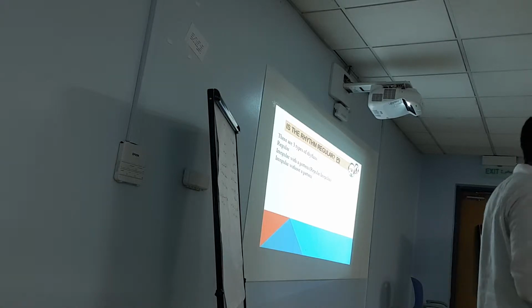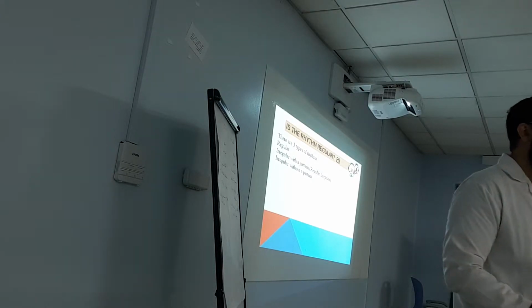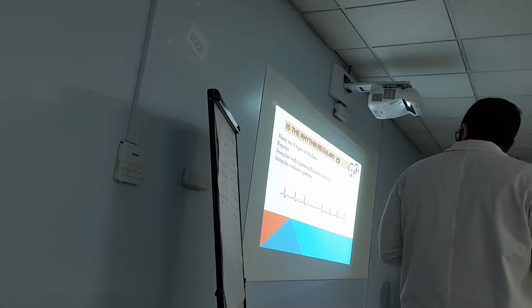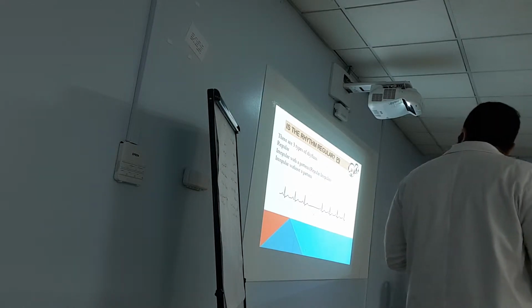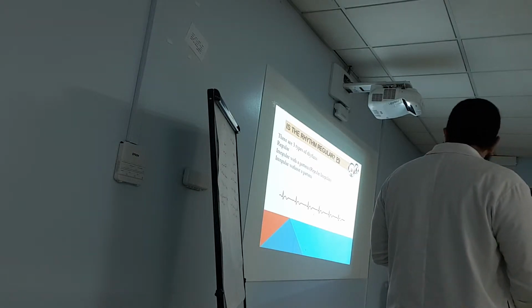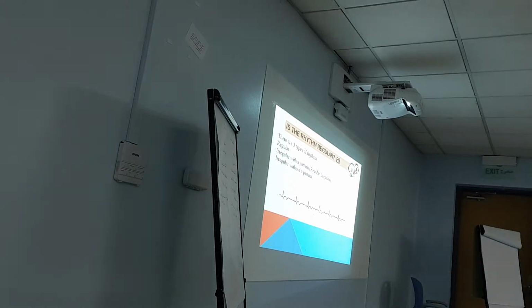So how to know the rhythm is regular? Regular means it's coming in fixed time, every 1 second, every 2 seconds. So how to measure the time? By the paper. Again, every 1 second, 5 large squares. So here, I will measure the distance between the waves and see, here is not equal. So this is irregular. Here, I will measure the distance between these waves. I find it equal. So the time is equal. So when we say something regular means in the fixed times, okay?